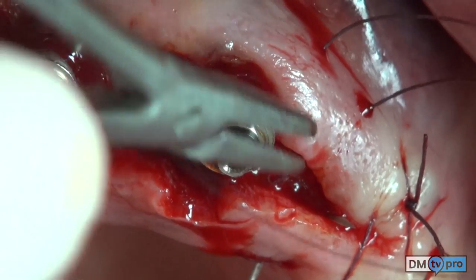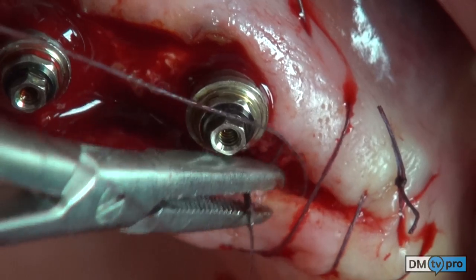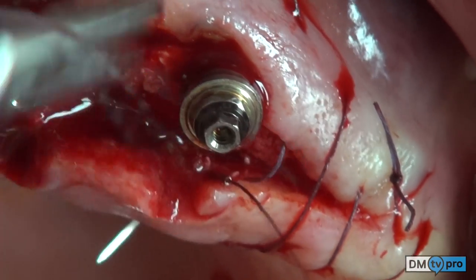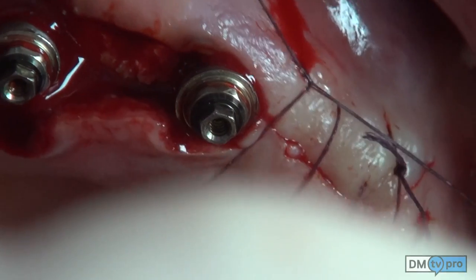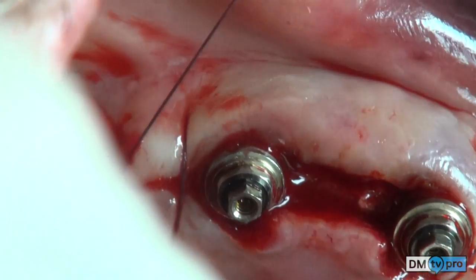To secure the flap between the two neighboring implants, a modified mattress suture is used — an internal one followed by an external one in a continuous manner.